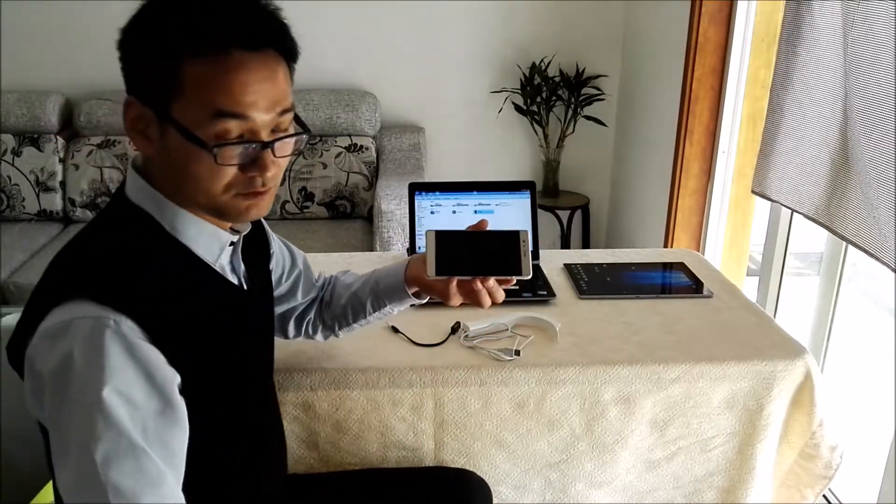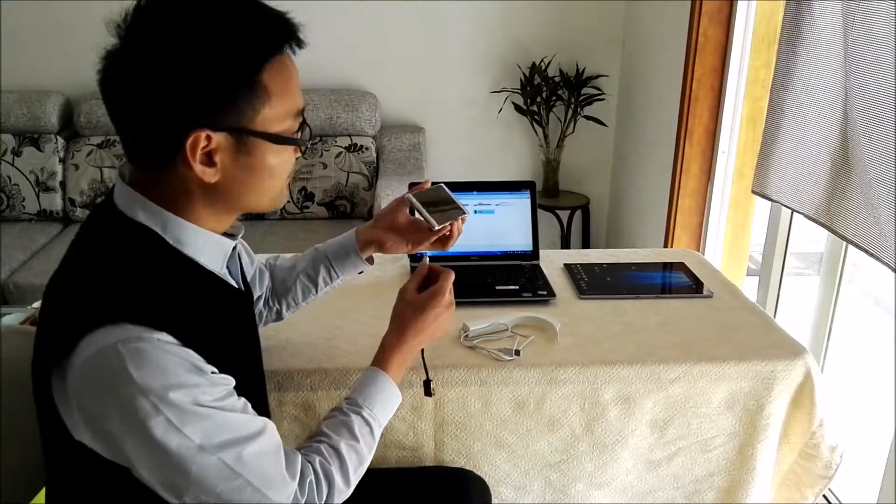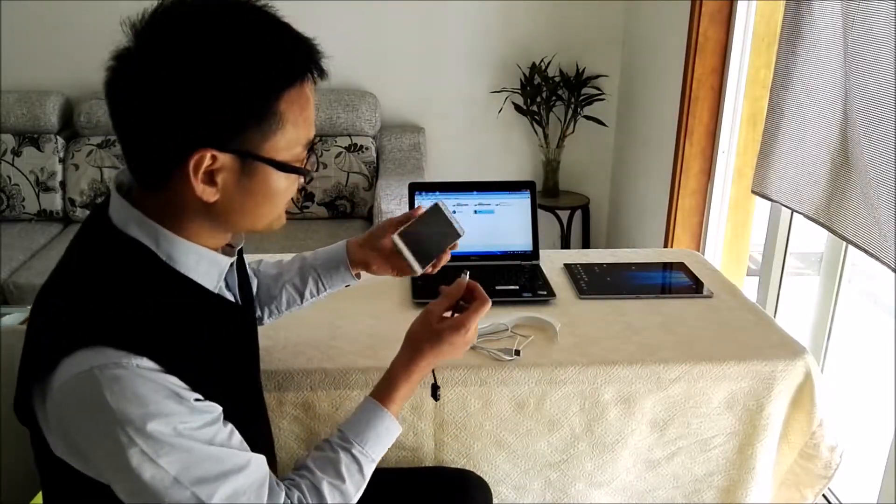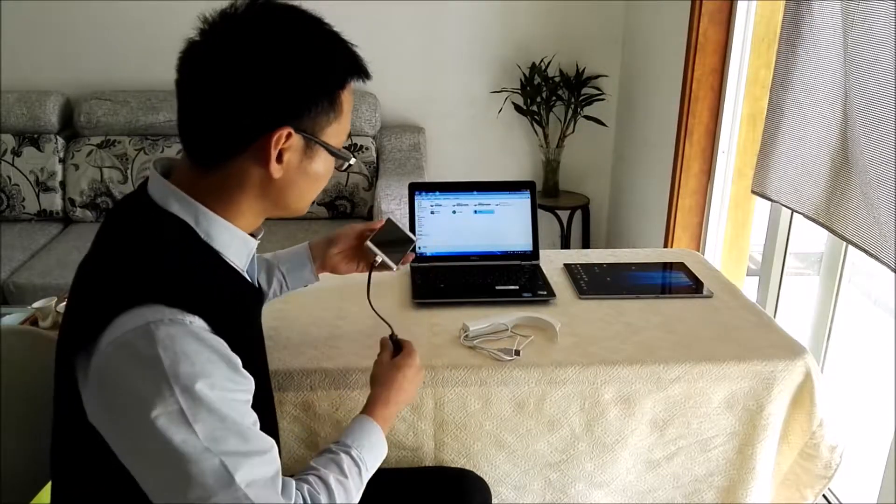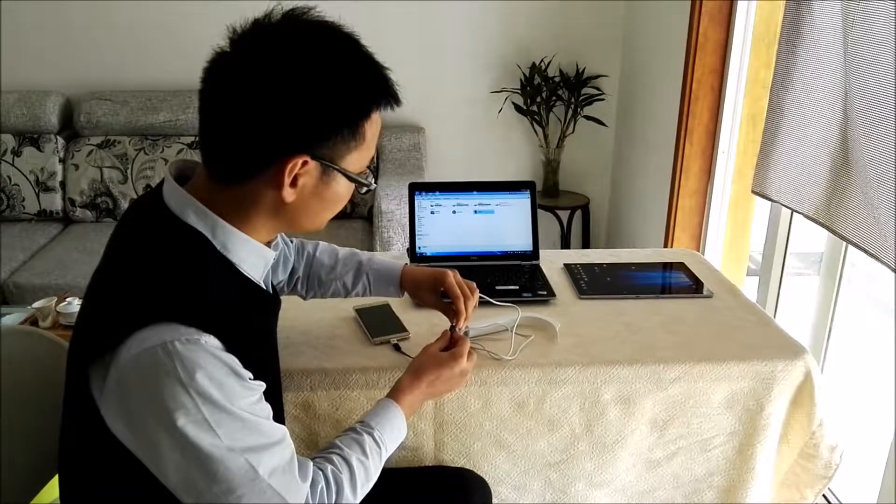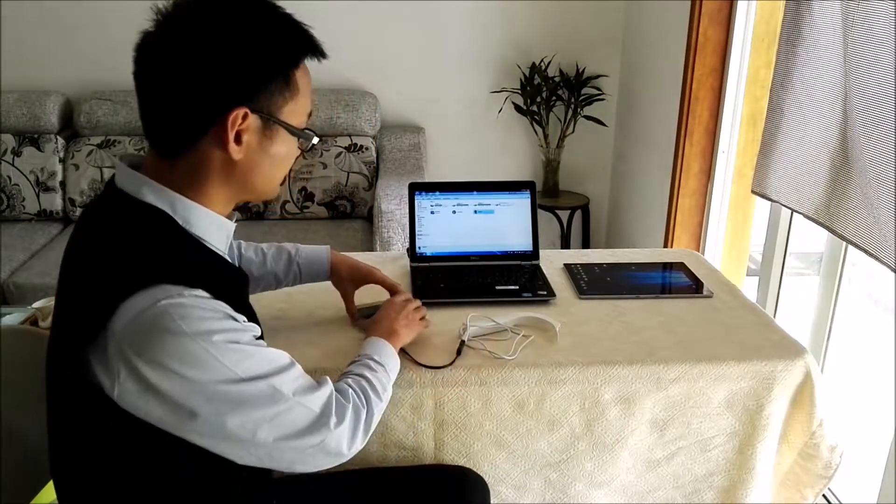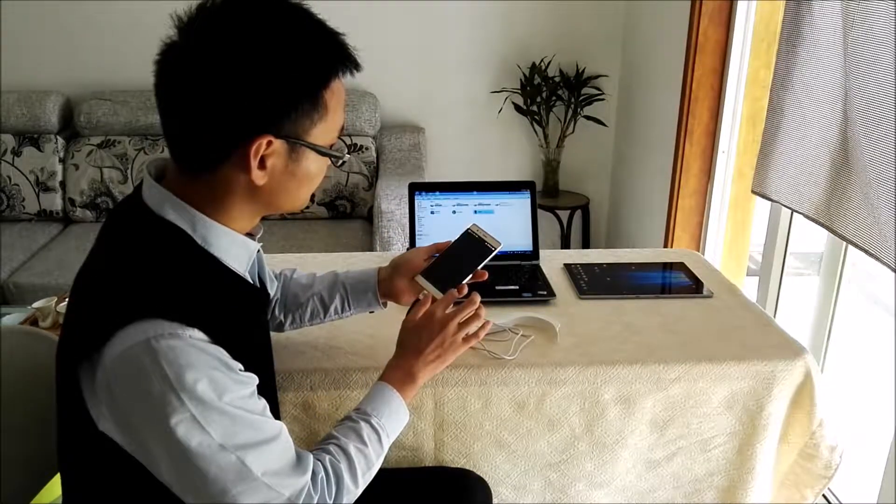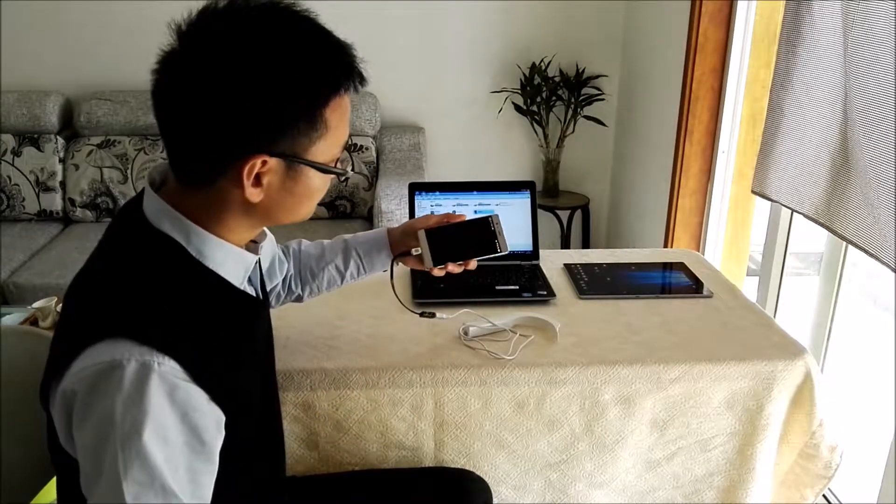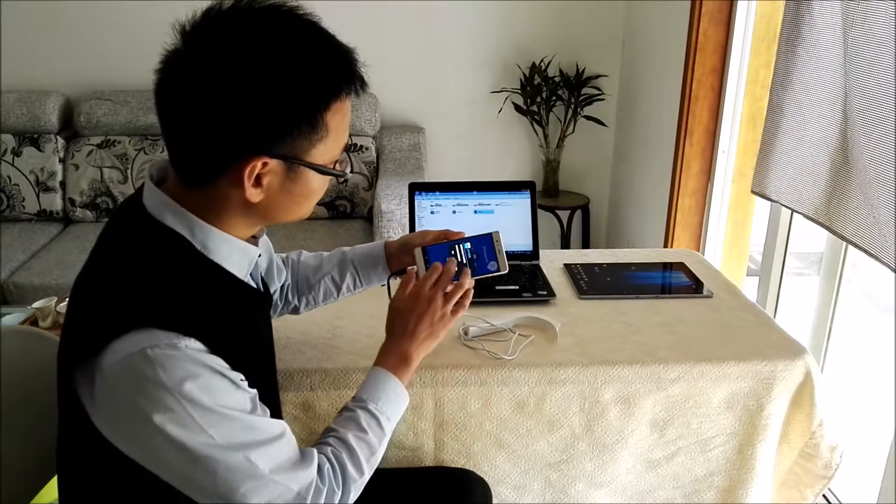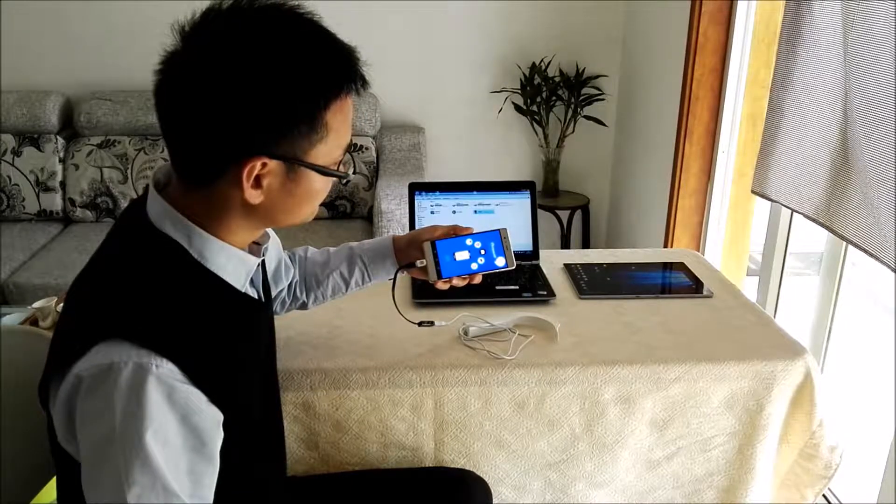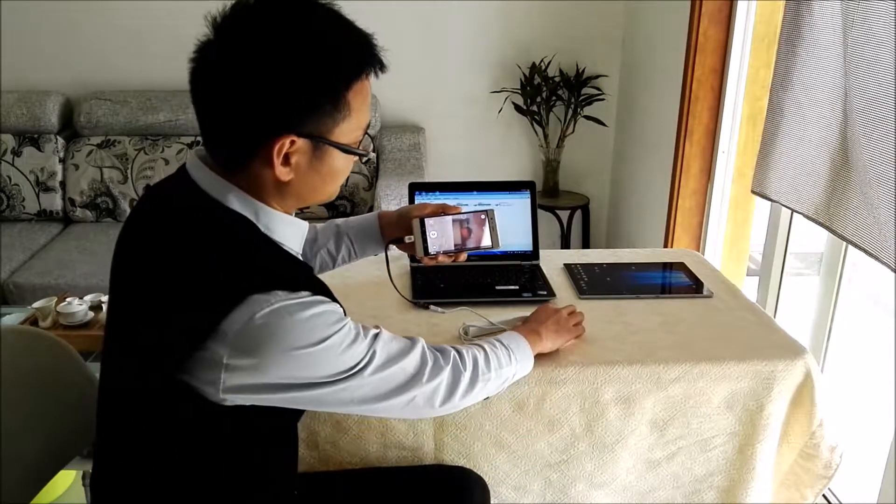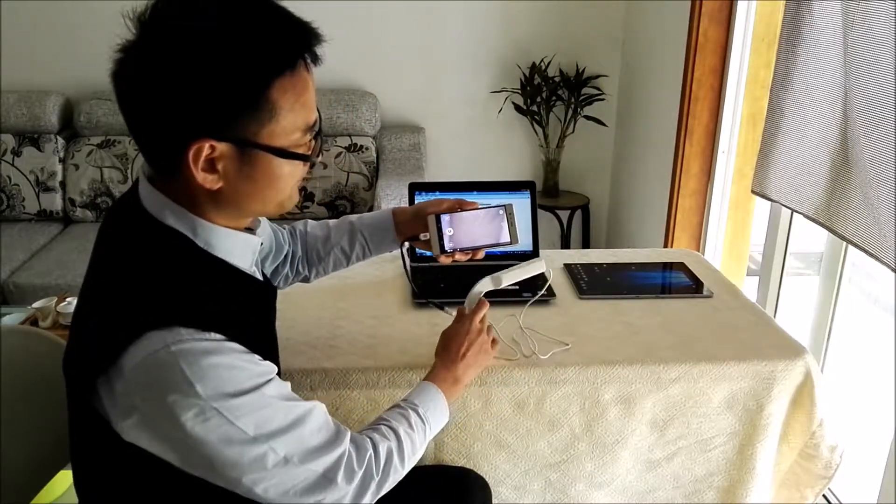This is my cell phone, Huawei P9. It has a micro USB connector, so I need a converter. Okay, it's working.